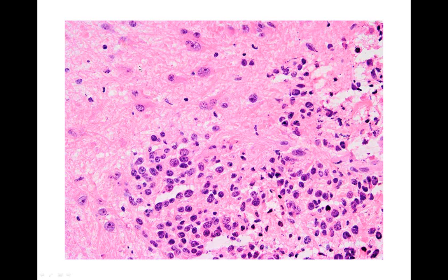This is a very, very important point, and I try to impress upon all of our trainees just how wild, how scary, otherwise non-neoplastic tissue in the brain can look under certain circumstances. We can see exactly the same kind of changes, for example, in a virus that's infecting the brain, if it's near an abscess, or a stroke. Tissue near a stroke will look exactly like this. In a demyelinating disease, like someone's got multiple sclerosis, cells near the areas of demyelination are going to look just like this, and they can look a lot like a cancer.